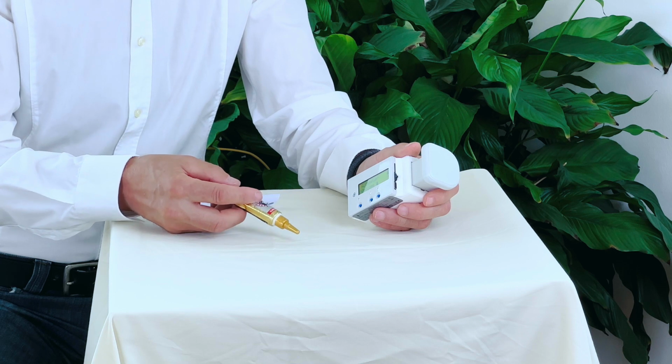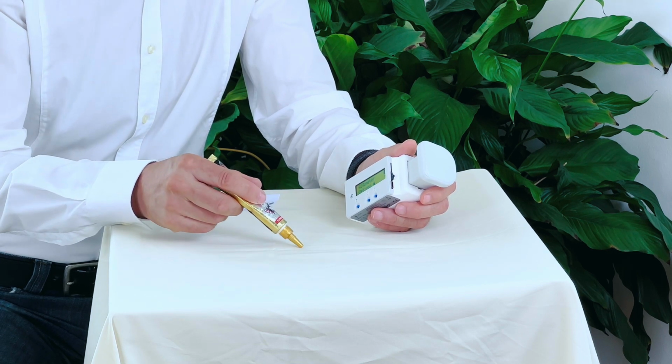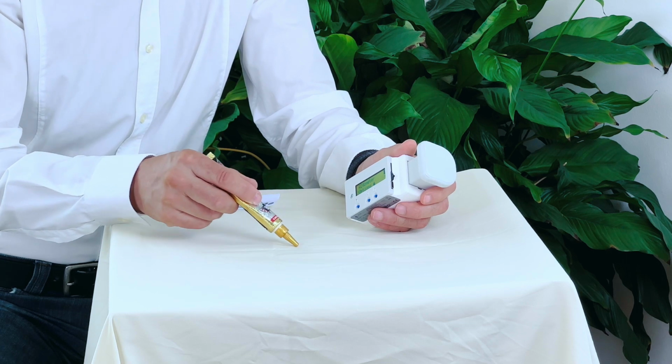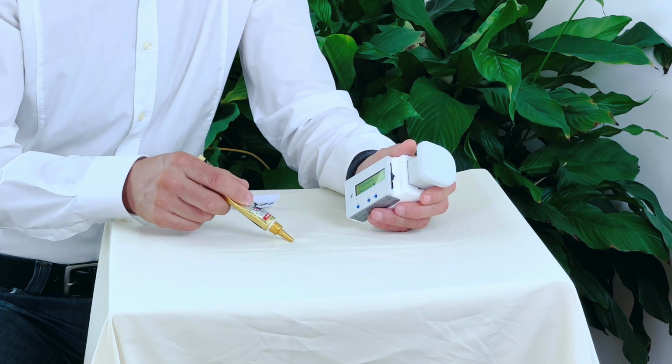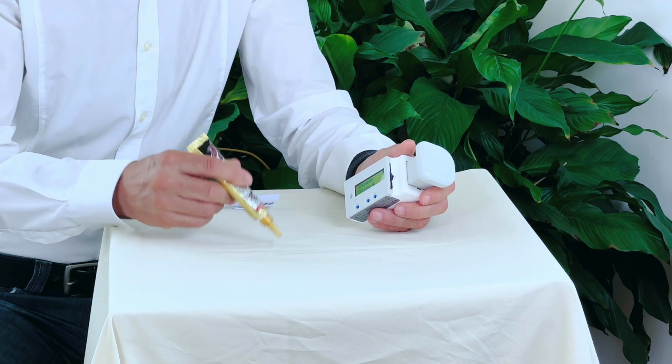And you can give the henna device to the patient and ask him to renew the marking whenever they notice that with daily showering it pales out, and then they can renew it.